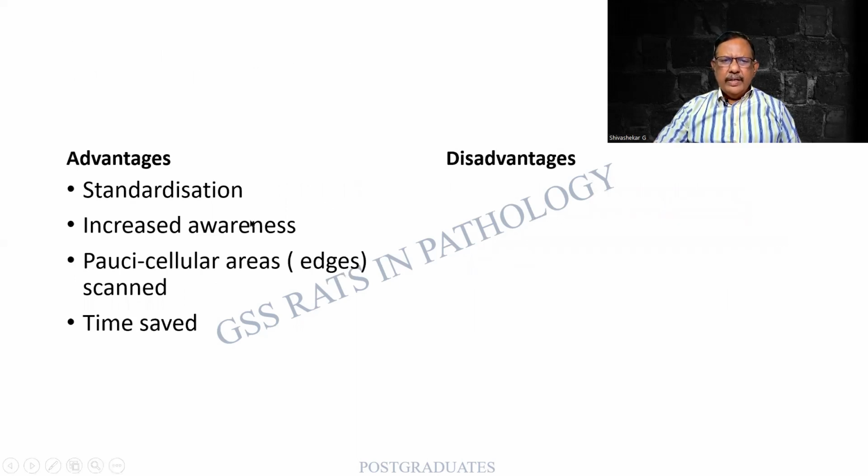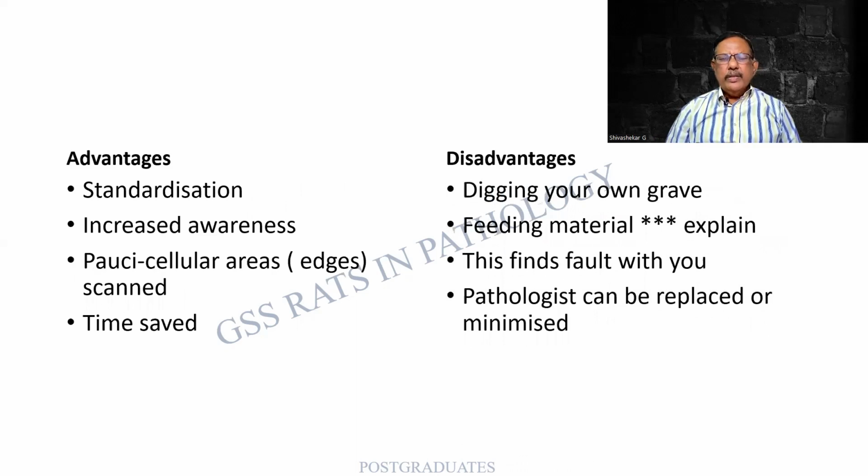There are certain advantages. Standardization is there because you are the person who is feeding into it. There is increased awareness, again, a post-biopsy wisdom. Even the paucicellular areas or the edges can be scanned. Obviously, it is too much time saving. The disadvantages obviously are we are digging our own grave. We are feeding the material, and then, as I told you earlier, it is subject to a series of analysis.